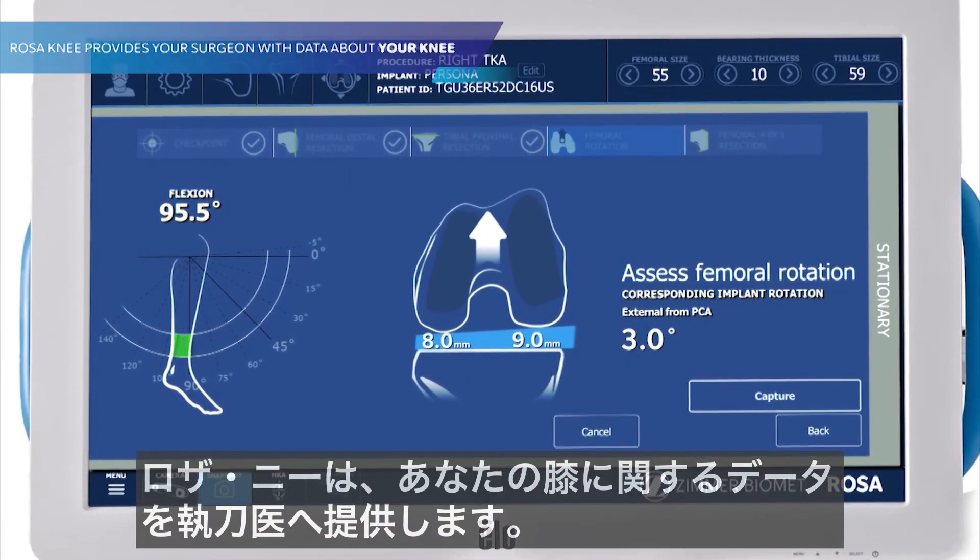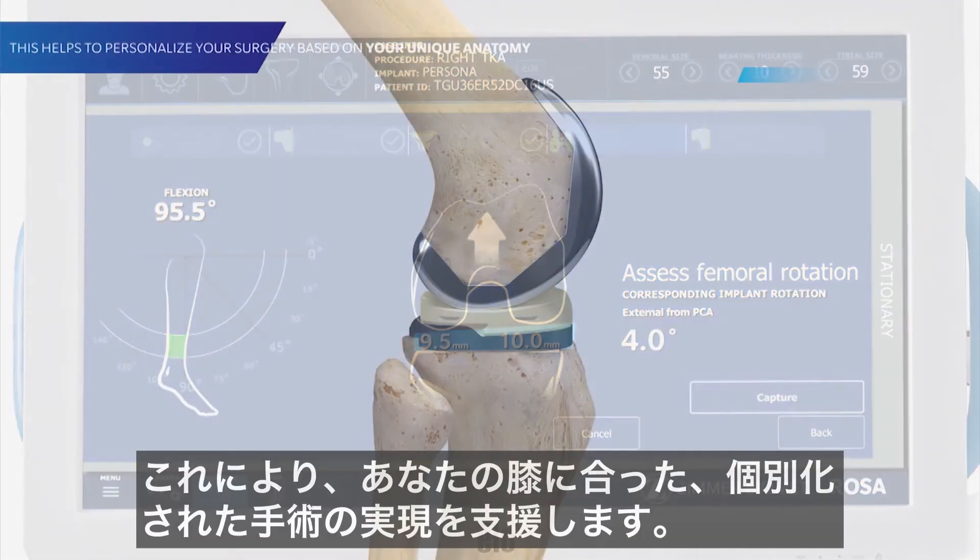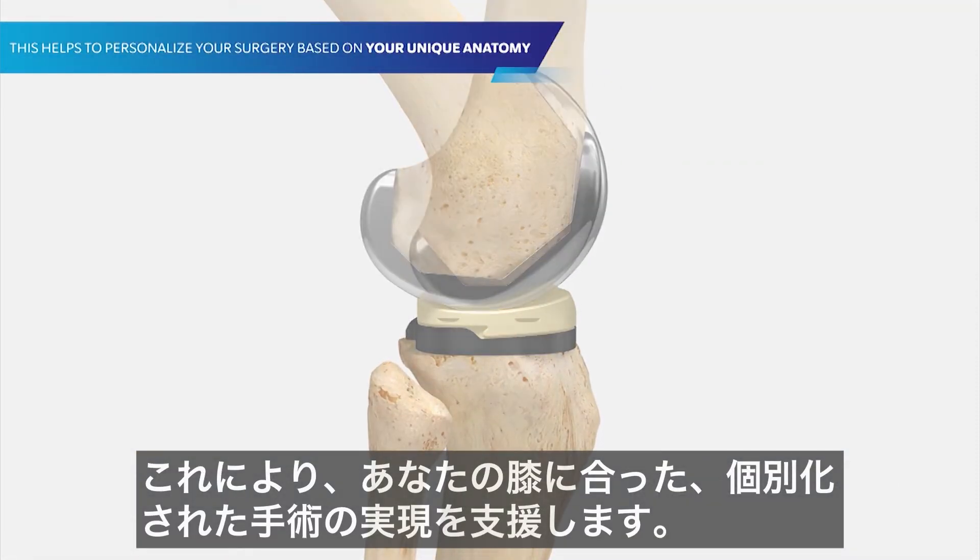Rosa Knee provides your surgeon with data about your knee. This helps to personalize your surgery based on your unique anatomy.